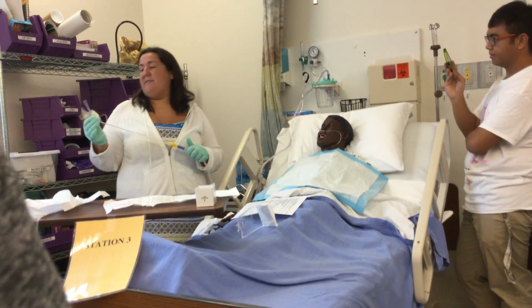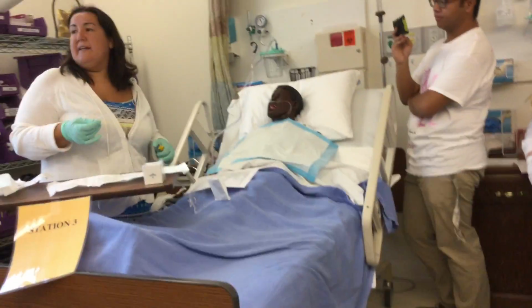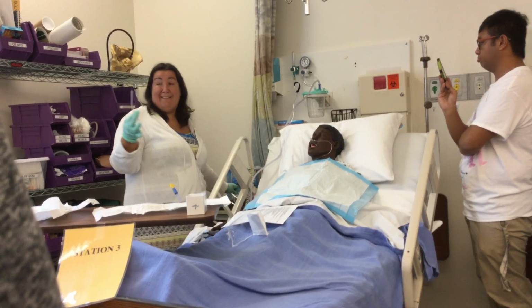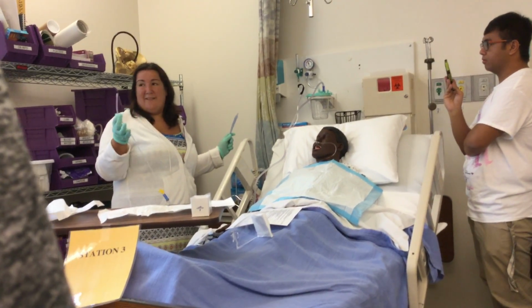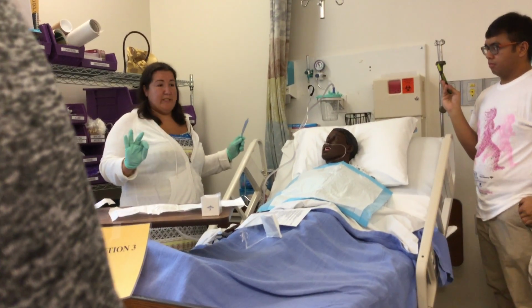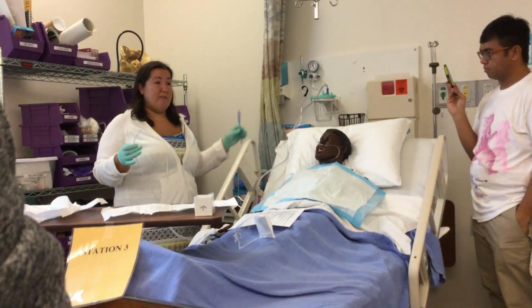But you won't want to do this if they are confused. If they're confused and they can bite down on that, then you don't want to do that. Then you want to use your Yankauer. Because if they bite down on this, they could actually take the end of the catheter and choke on it. So if they're really confused and you think they're going to bite down, then I wouldn't even do that. I would just get rid of my catheter and then get your Yankauer and suction out their mouth if you're seeing stuff in there. And you will lots of times.